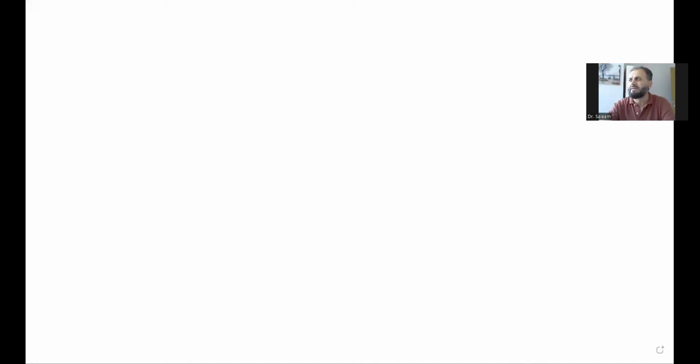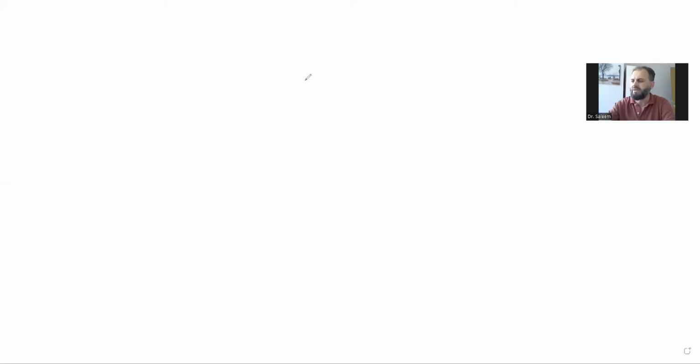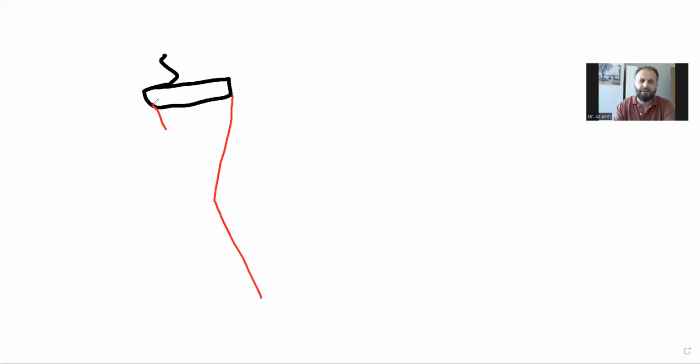Let me show you guys by sharing the whiteboard. Maybe that makes it a little bit easier. For example, when we are scanning, pretend this is a probe and you're scanning from here. Now we all know that we will have a beam made by this transducer, which will converge and then diverge after that. It is like a virtual beam, we don't see it, but we think the beam is like this. Now all the pulses will come straight this way. So this is the main axis beam, with the red color you see.